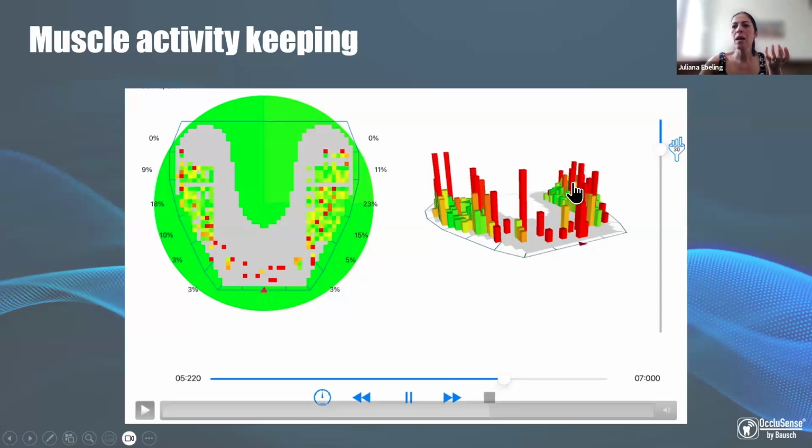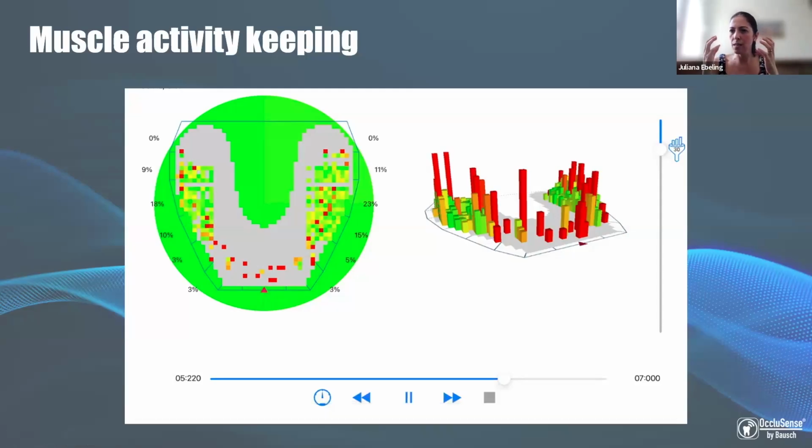This teaches that scanners have some limitations for this, and there is no better or worse device. They are complementary, and it depends on what I'm looking for, which kind of information I need. That determines the device that I will use to get that information.